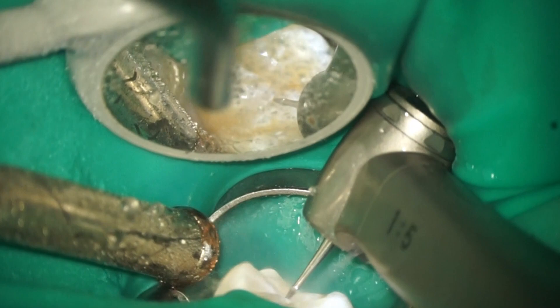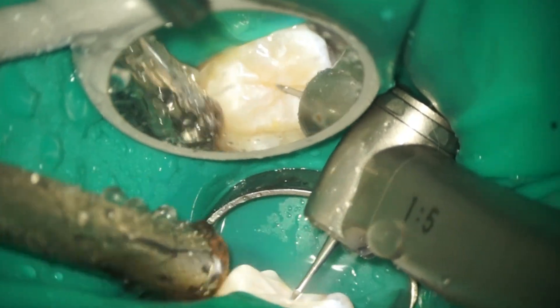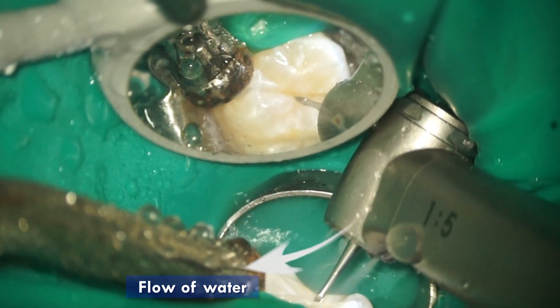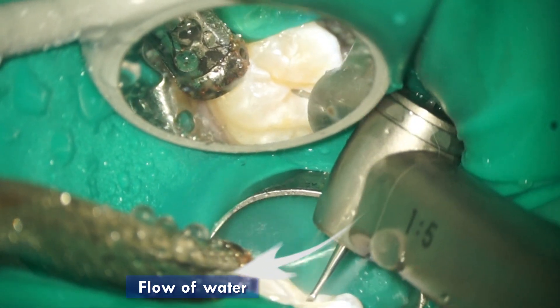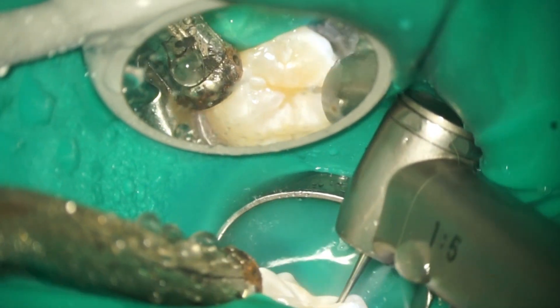Achieving clear vision from water droplets is the first obstacle to mirror work procedure. Before placing the suction, think of the flow of water from the handpiece and how it drains into the suction tip. The best suction position is one that shortens the movement path of water, preventing droplets from dispersing onto the dental mirror.